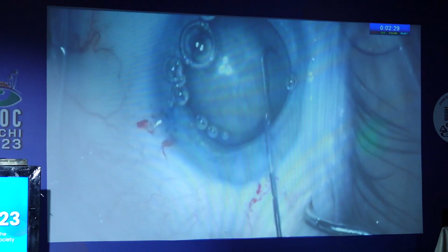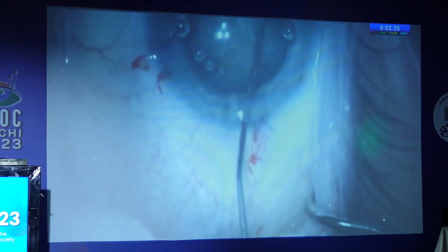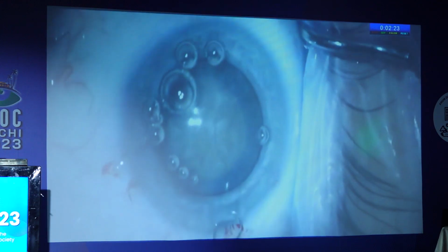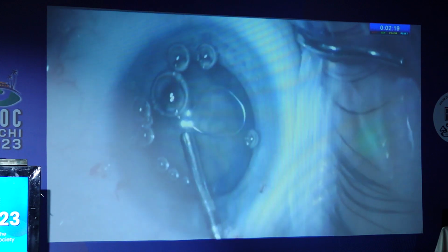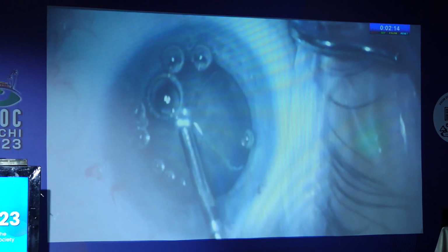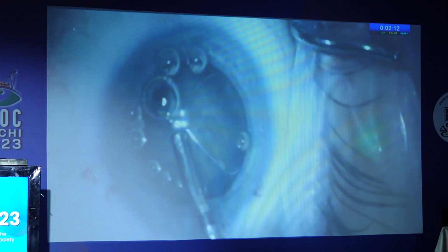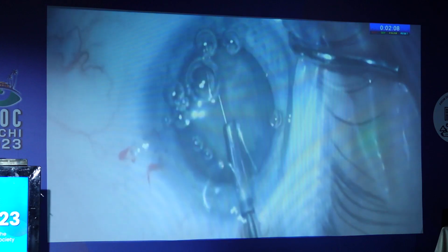Now this is another case where it's a hard cataract. In the first one, there was a lot of cortex, so you could not see it properly. That is why this second case is shown. So, hydrodissection, rotation of the nucleus to be really sure. See, lying flat, entering in, and now we are expanding it slowly. Let it go underneath. Over here, the silver reflex may be muffled or may not be seen at all.